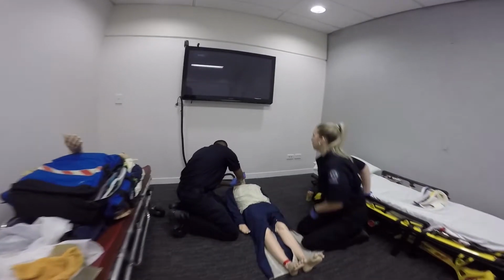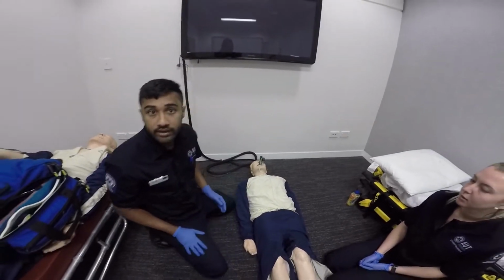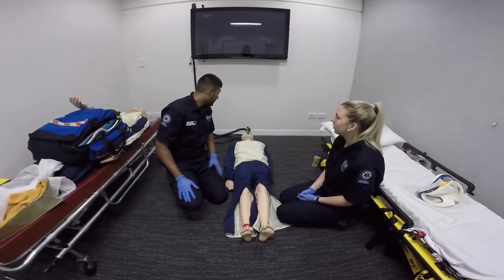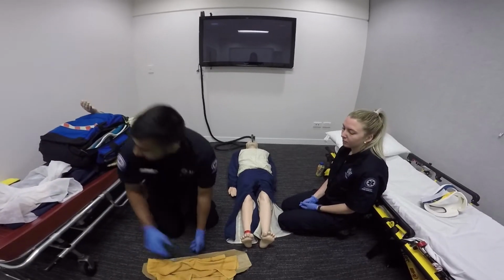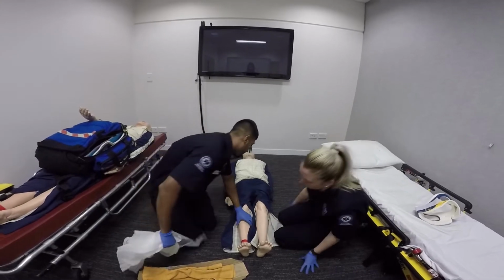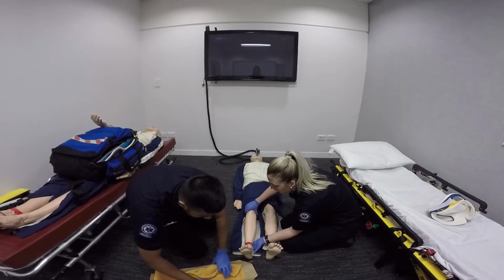So the patient can just breathe that as required while I do the splint. I'm just going to place a box splint on you, and how I'm going to do that is I'm going to use this as well as 2 triangle bandages. Shawnee, if you could just hold the patient's leg up, so I can put the box splint on.